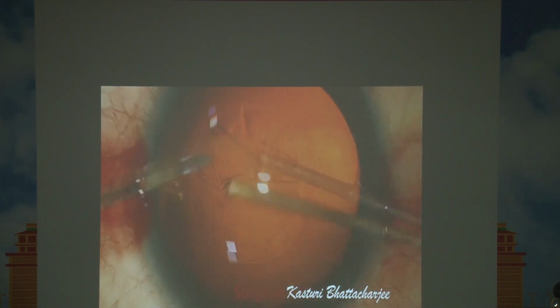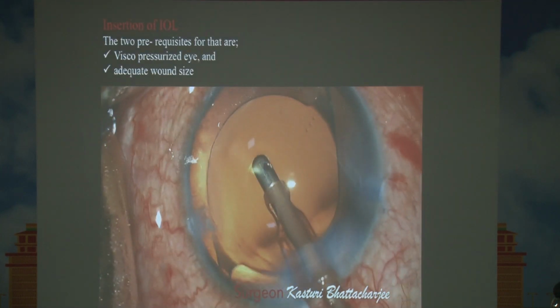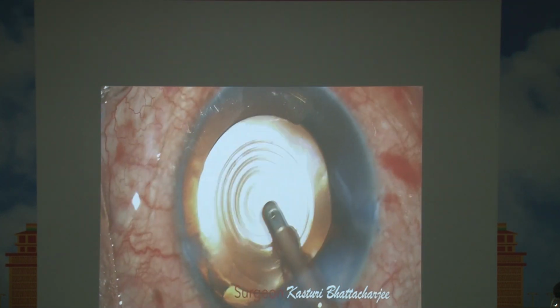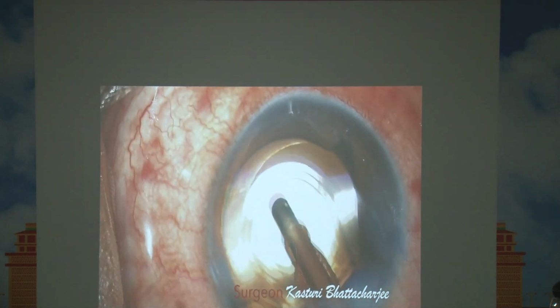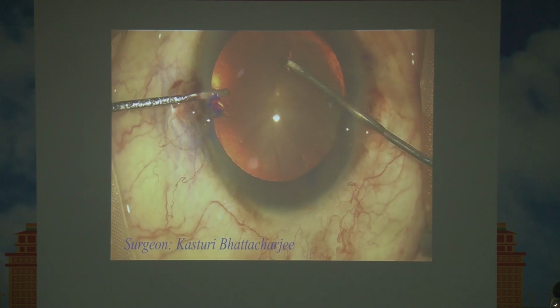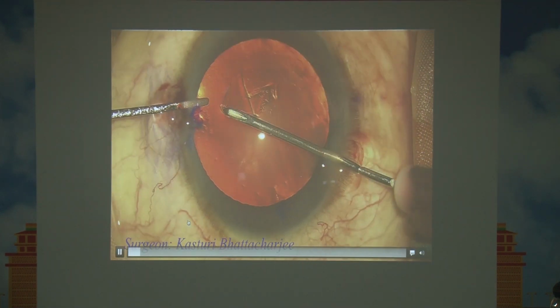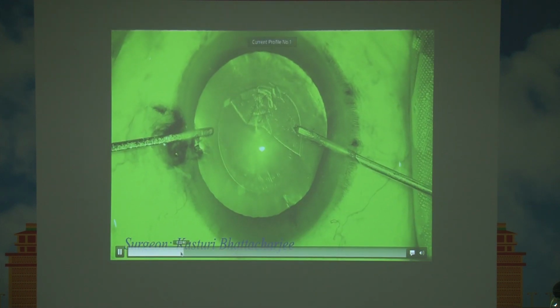Especially when you talk about the basics of cataract surgery, the rhexis definitely plays a very important role, and this also helps you to consider thinking of the premium IOLs. So this is also very fast, the different steps. I think I will not be showing this video because of the paucity of time. So this is what we want.